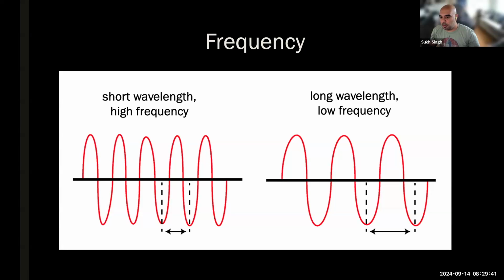So if you see these waves going in and out of the axis so quickly, you get a lot more data information. And if the waves basically pass through the information, you might skip something. The most intuitive way to think about it when you start scanning is whenever you're doing anything in the body, the chest, abdomen, pelvis, anything like that, you're gonna want the low frequency wave because you got to look deeper. And anything you're doing in the arms, in the neck, in the head, in the legs, you're going to want the high frequency probe.